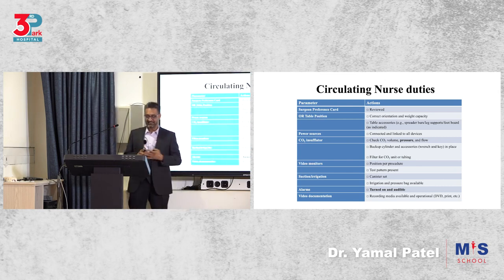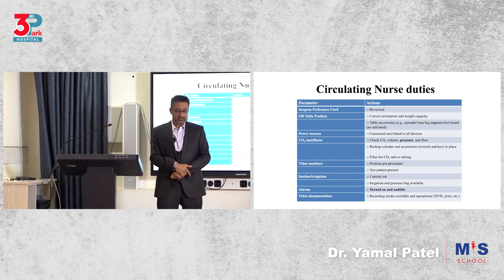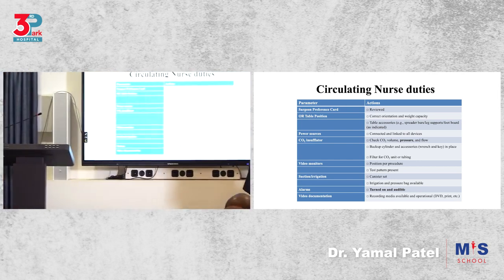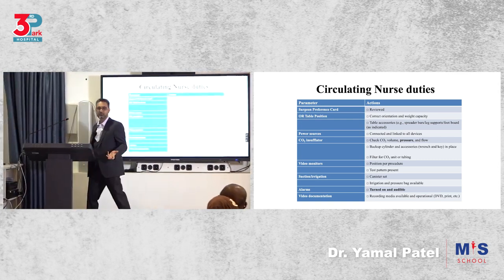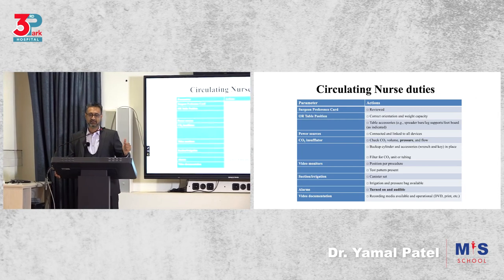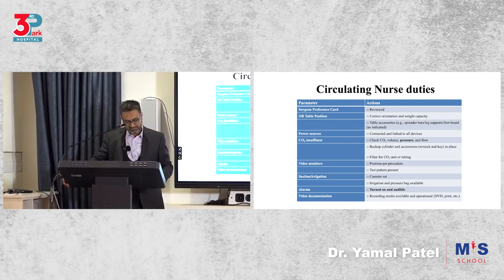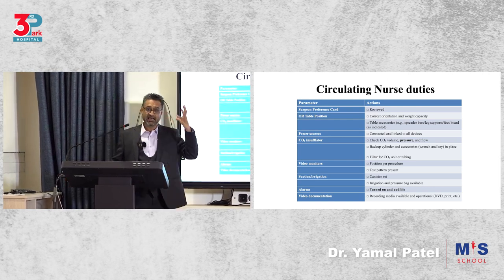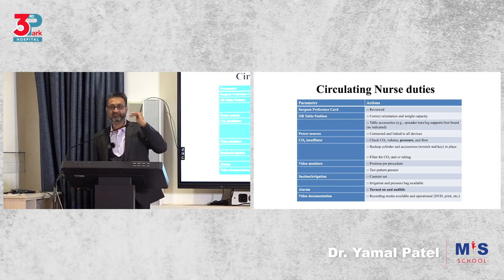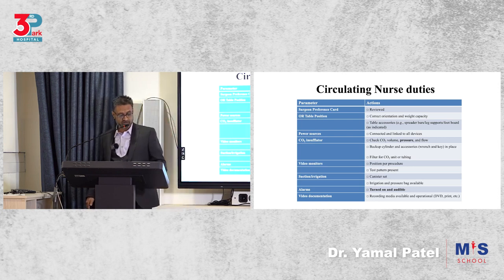It should be on the checklist. Then suction irrigation: not when I need it and there's a bleeder there, I'm like, suction, okay, I'm connecting. I mean, connect it, keep it ready, test it. What's the problem? You know you're going to use it, then connect it. So that is what I meant by checklist, okay? So is the alarm on and audible? I told you, when you're pressing something, is it loud? So that someone is alerted when something is pressed by mistake. Is my documentation, my flash drive in there, is it ready to record?